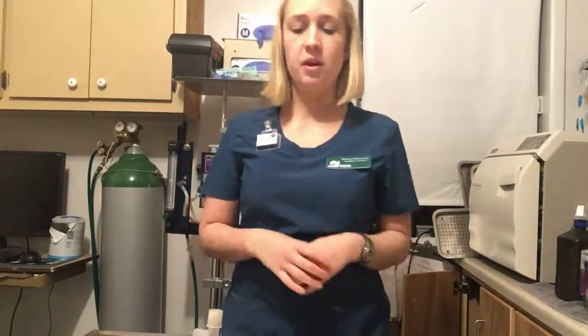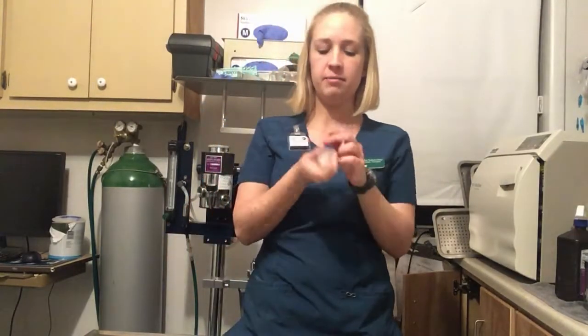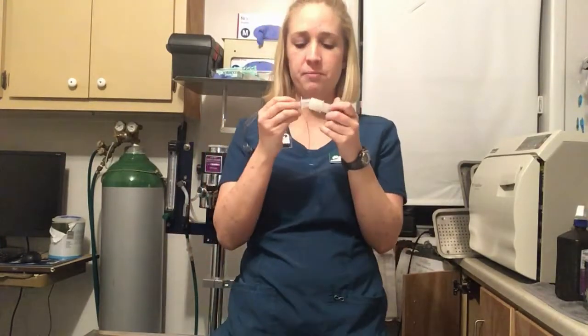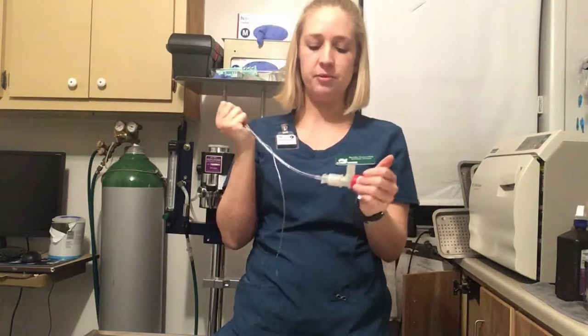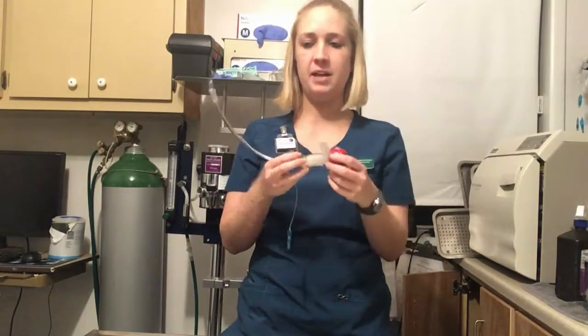Also, in addition to monitoring the heart rate and the pulse oximeter, you want to monitor your respirations, whether you're using the endotracheal tube or an esophageal stethoscope. The one that we have attaches to the end of your endotracheal tube, and as the air passes through, it sends off little chirps that indicate that air is being passed through it.